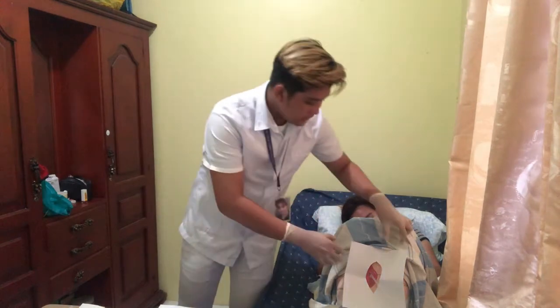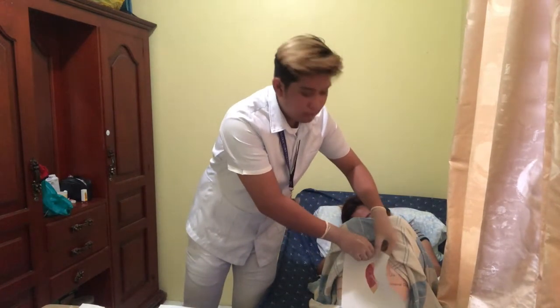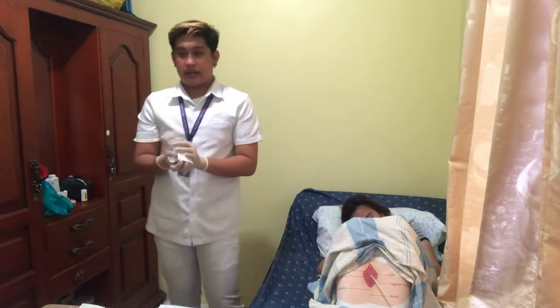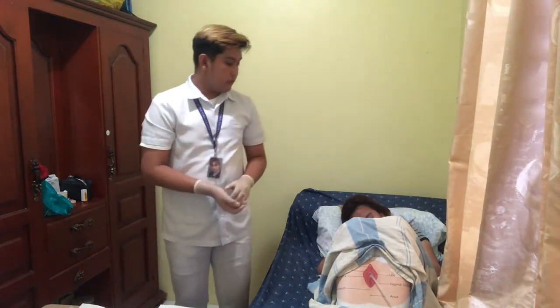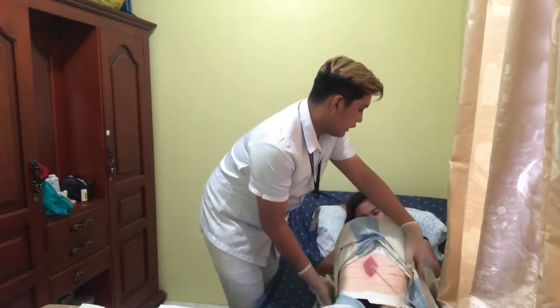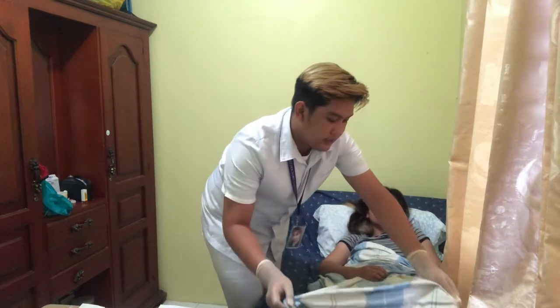So after the process, we'll now place our patient comfortably and do the aftercare. First, I'm going to remove the eye sheet and discard it. Now we're going to lie down the patient comfortably. Okay, now you lie down.